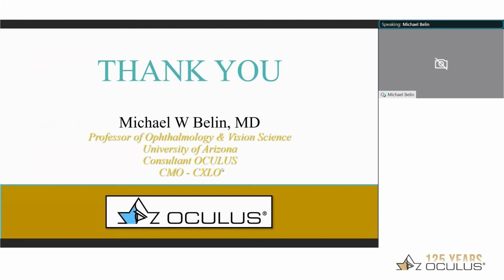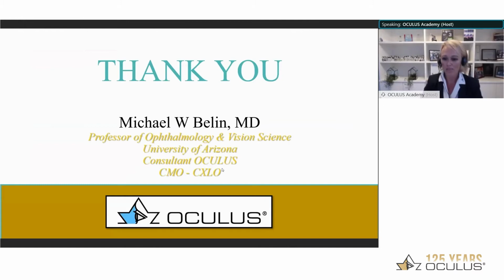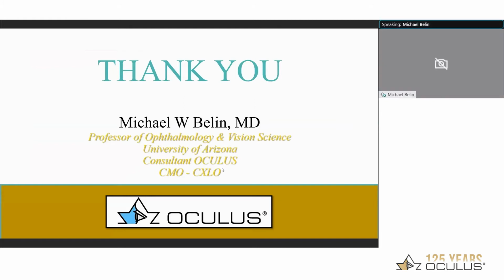Thank you. And then I think a last question, what is your criteria? When do you treat a patient? When do you cross-link the patient? So let me go back to that question before this. Obviously, if you've done a cross-linking and you want to follow the patient, then you have a new baseline. It's the post-cross-linking data. So you're not going to go back to pre-cross-linking. But basically, you're looking for change to a baseline exam.